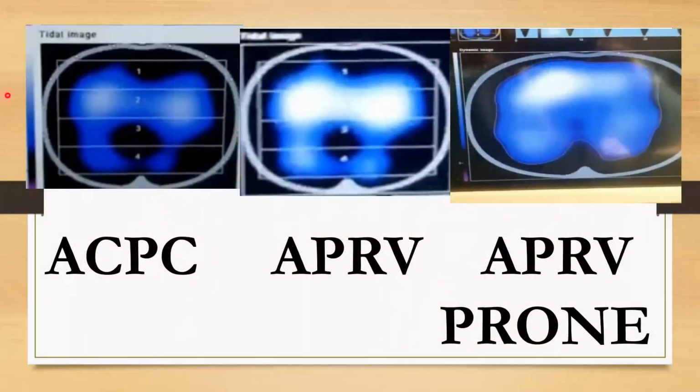So here you see within basically an hour and a half, while we used the EIT to guide all of our decision making, we were able to get the patient from here on an FiO2 of 100 to over here, like we had mentioned before, right away turning the patient prone. That would have helped the ventilation to perfusion because we did have good ventilation there. We had a very impressive result. If you notice in the video, we're using a very modest P high of 18. We were stretched to a T high of 5, and we're at 35% oxygen.